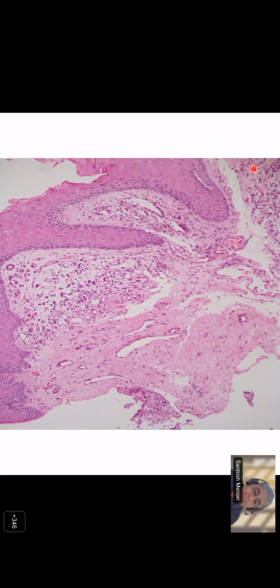A slightly hyperplastic-looking squamous epithelium, which invaginates. What do you see here, Ruchika? Sir, here in the subepithelium, we could see some cystically dilated spaces, along with some edematous changes and inflammatory cells. So you mean to say this is a space or a vessel? It looks like a lymphatic to me, sir. Lymphatic or a blood vessel, it's a lymphovascular space.